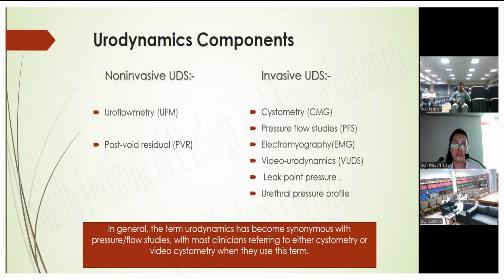Okay. So we can divide the urodynamic components into non-invasive and invasive. As Dr. Sama said, UFM, which is usually performed in our clinics, is a non-invasive UDS, and post-void residual also. While when we consider UDS, it becomes synonymous with the pressure flow study, then most clinicians refer to either cystometry or video cystometry while using the term UDS.